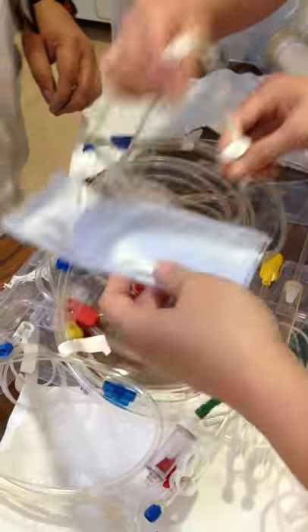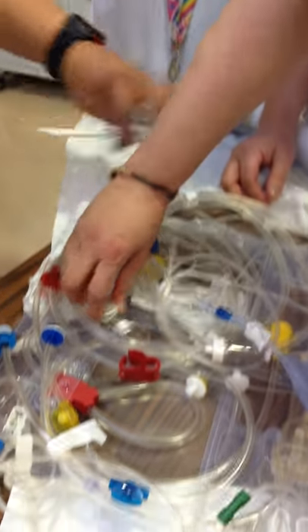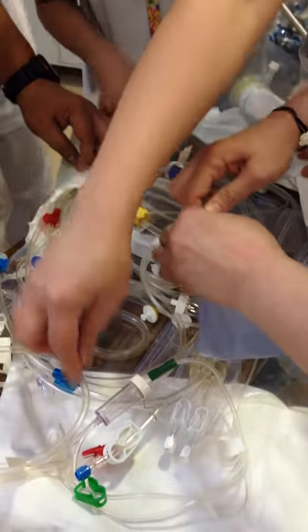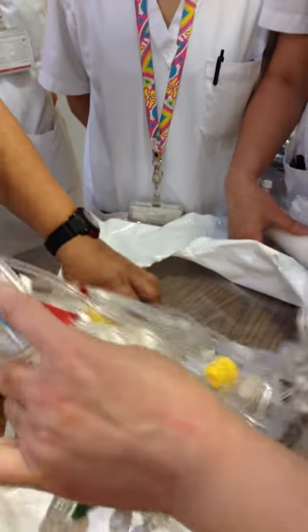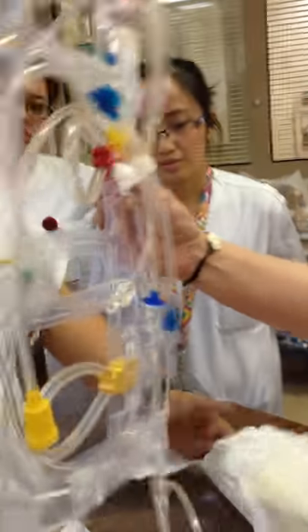Okay, we're going to spike. Spike down. Okay, close. T junction, this one all the way. Clamp. But we will give you instructions. Alright, now. And then you have the two extra connectors, always keep these. And you have a recirculator. For this one, you don't recirculate.